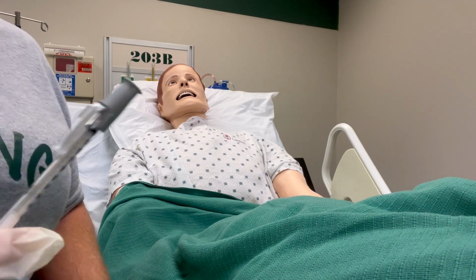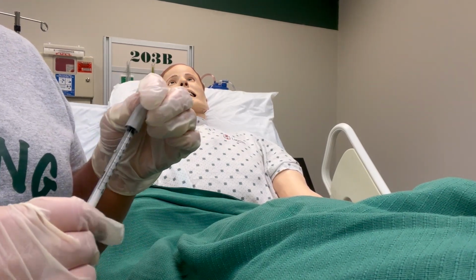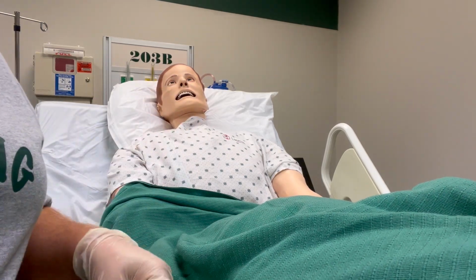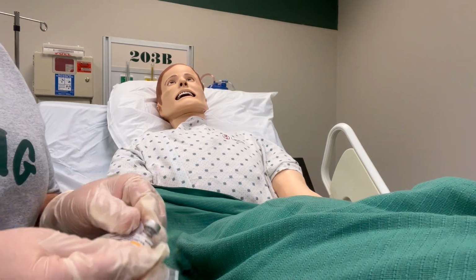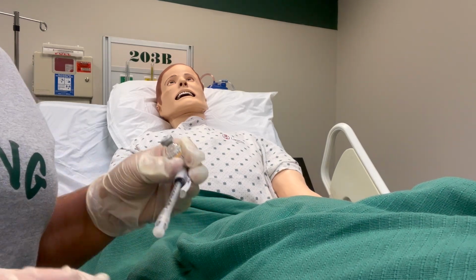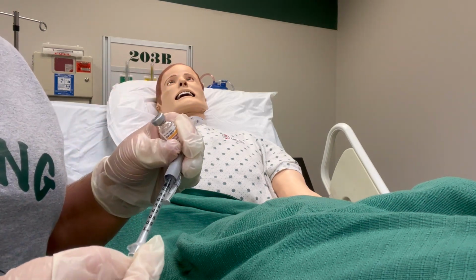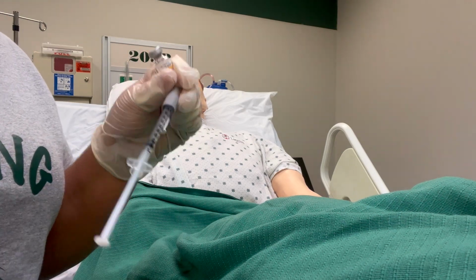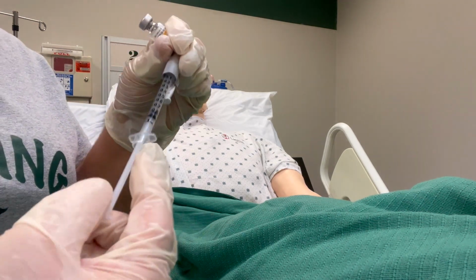Okay, so I'm going to use my TB syringe because it is generally the best option for a patient who is going to get a heparin. I'm going to pop the cap of my heparin, and I always like to scrub it. Remember, whenever you're drawing up, you need to draw up the amount of air that you're giving. So I'm going to draw up 1 ml. With your TB syringe, remember, you're going to have a large part of your plunger out because we're giving the whole dose of the syringe.